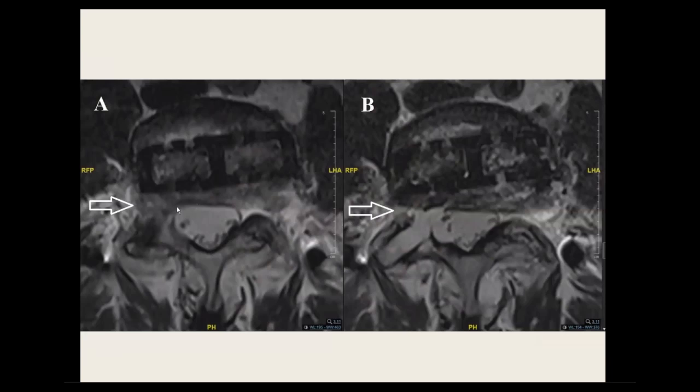So I didn't stop the surgery here. I introduced the tubular retractor here over the disc, turned the bevel upside down and the scope upside down as I removed the disc herniation, because when I looked up, I could see the cauda equina. Now, I was able to complete the surgery successfully. The patient went home the same day. I recommended about 2 days of bed rest, and his symptoms were resolved.